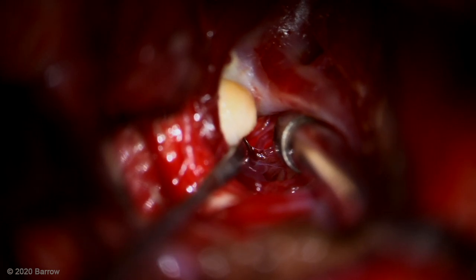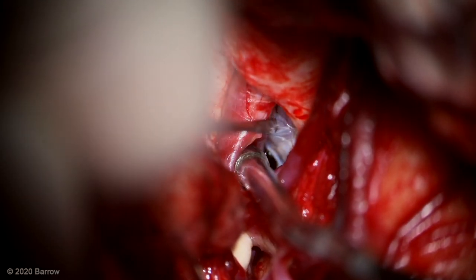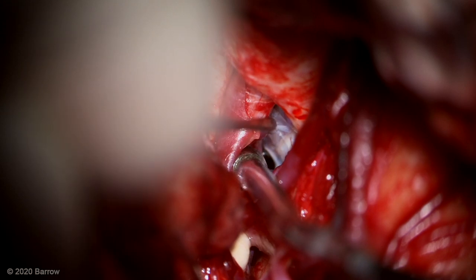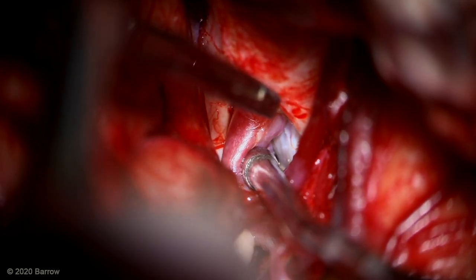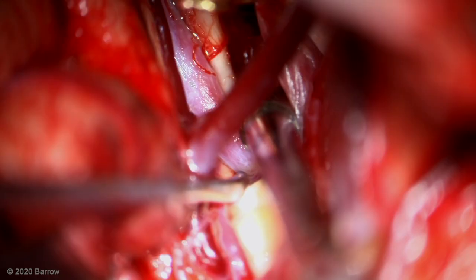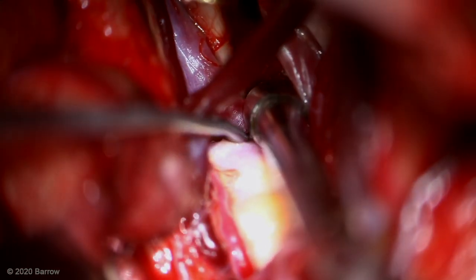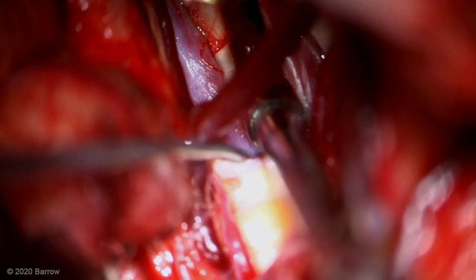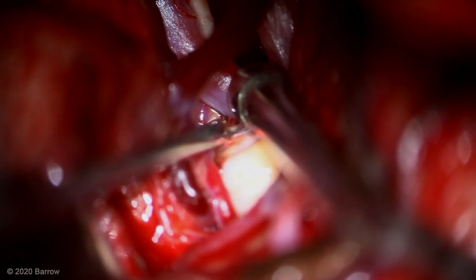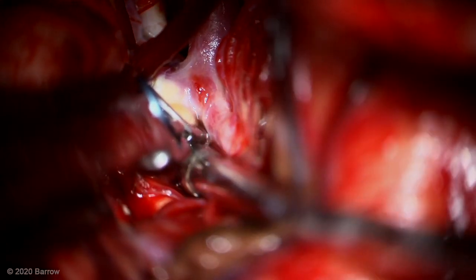Here now we're moving behind the aneurysm to identify these perforators off of the back of the carotid that might be jeopardized by the clip. I'm going to use a temporary clip as I finalize my dissection and place my clip. You can see that to get into that cleavage plane medially requires some pressure on the aneurysm to open up that cleavage plane.